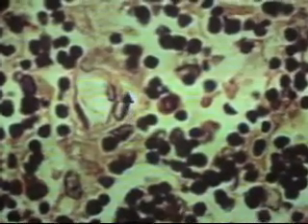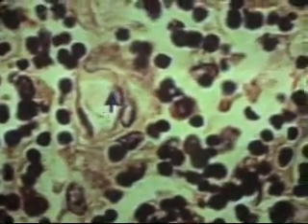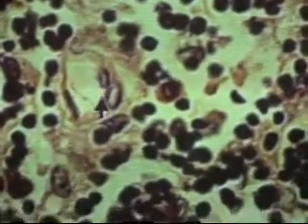Okay, so here you see the blood vessel, and if you remember the blood vessels, this is likely the endothelial cell, and then there is the other endothelial cell where the nucleus protrudes towards the lumen of the blood vessel, and then you also see this cell right here surrounding it.